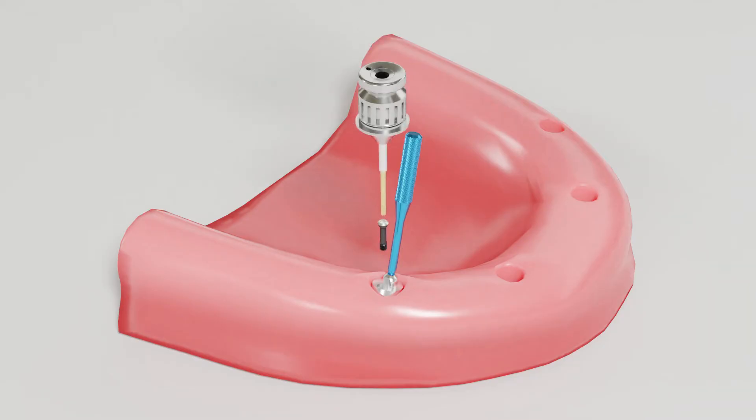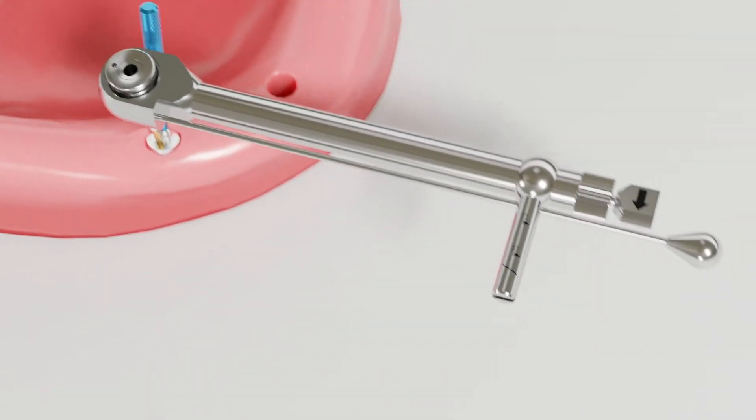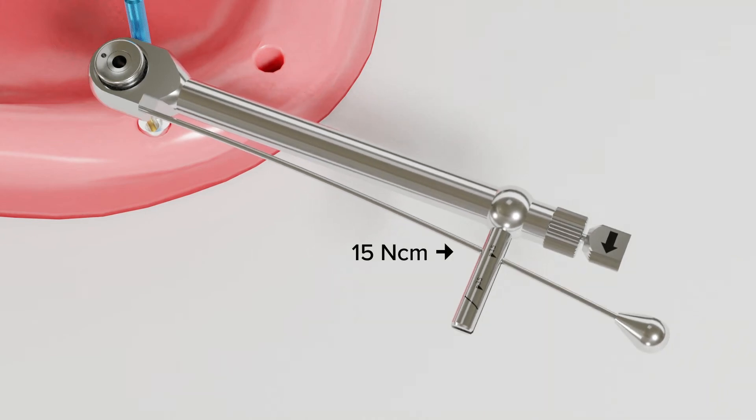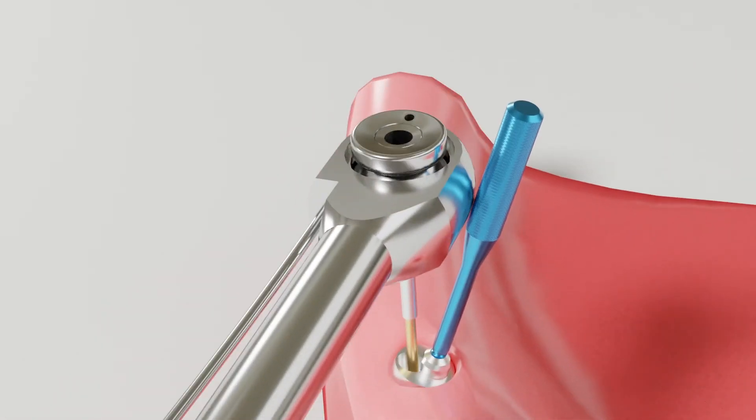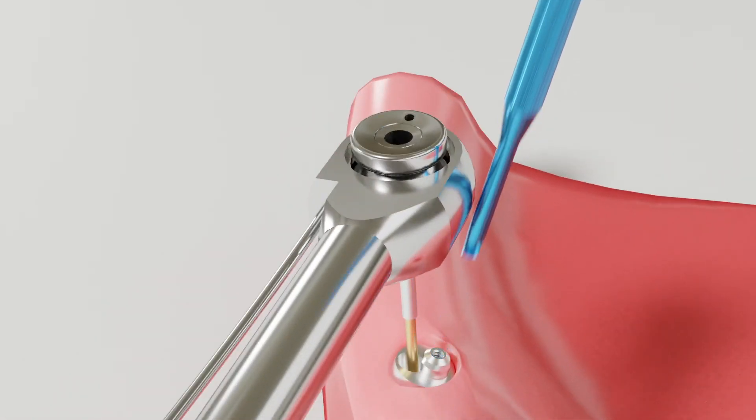The angled multi-unit abutment screws get torqued into place using the standard uni-grip screwdriver. The recommended torque for the angled multi-unit abutments is just 15 newton centimeters, instead of the 35 that is recommended for the straight abutments. Once the abutment has been torqued into place, the holder can be unscrewed from the top of the implant.